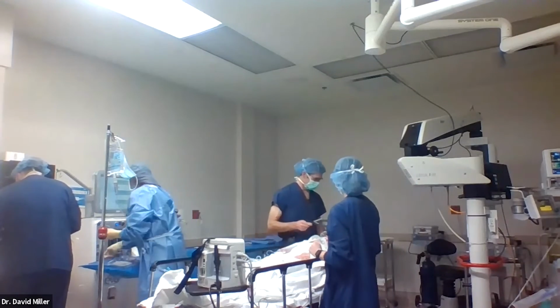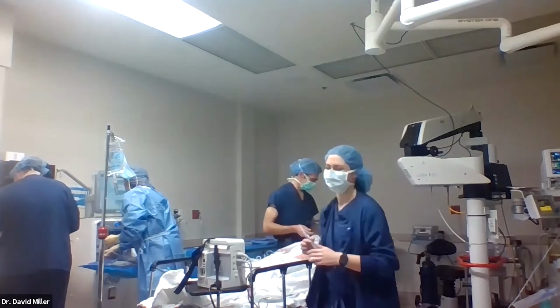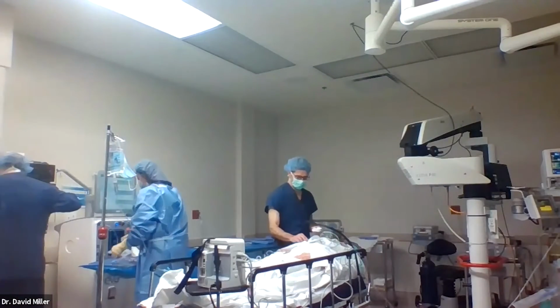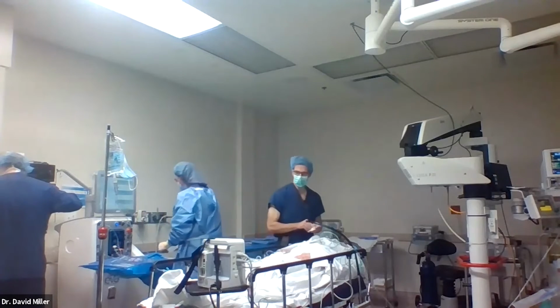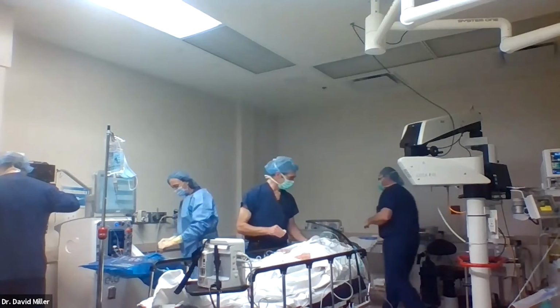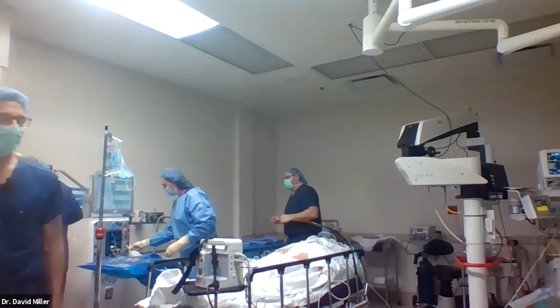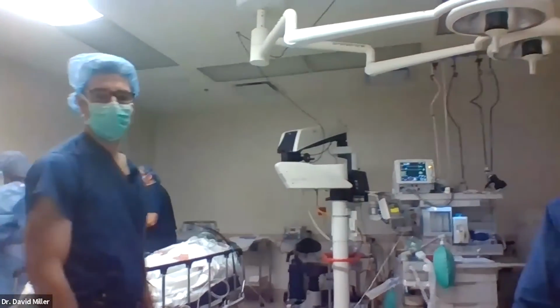So Julia's, we do cases like this, and sometimes you don't even think too much about the steps that have been the same for many, many years. Not bad, huh, John? We'll get you drapes over your head in a moment, and we'll get the case started.